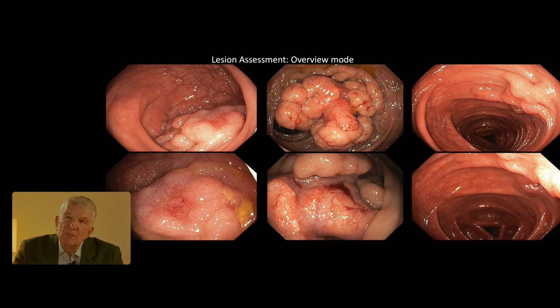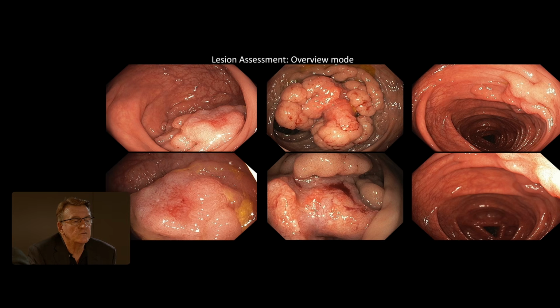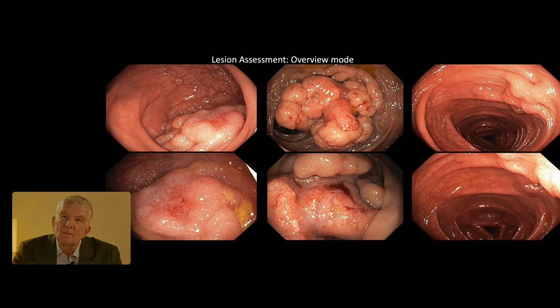If you take the upper picture, you see something reddish, and this is the area where you will focus, and then you detect that something is wrong because it's irregular, bloody, etc. Usually if you see a big nodular lesion like this, the nodularity is homogeneous, it's all flowering outwards. But here it's missing its nodule in this area. And if we look more closely, there's a sharp cutoff to this dusky area where you can't follow the pit. So this is cancer here, deeply invasive cancer.